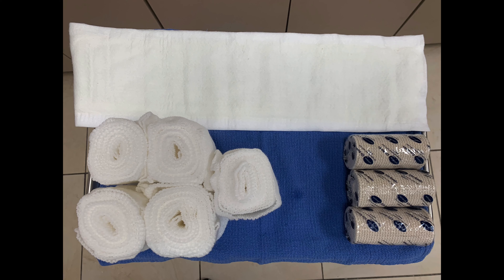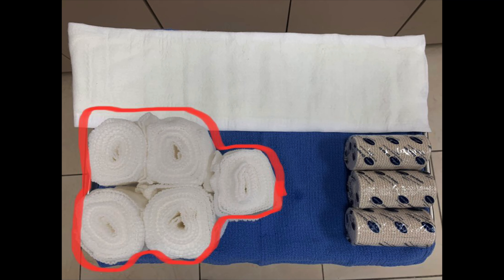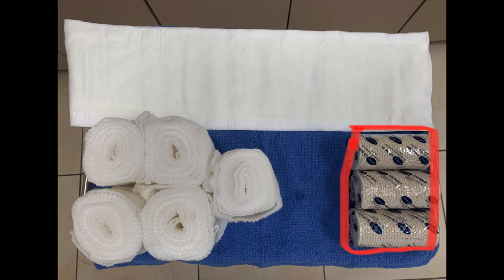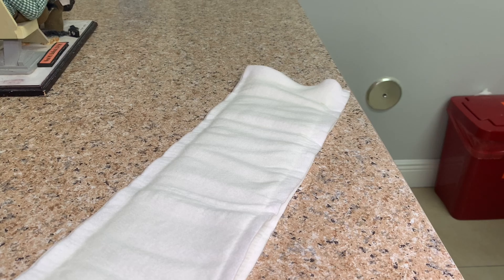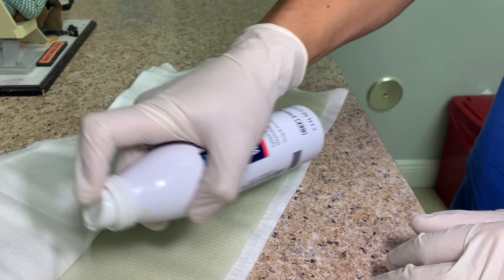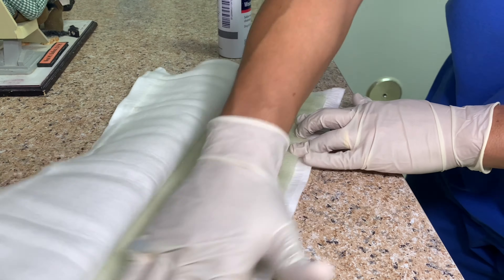The materials needed for the splint are 30-40 inches of 4 inch wide splint material, 5 rolls of 4 inch wide cast padding, and 3 rolls of 4 inch wide ace wrap. I suggest making a heel pad with one of the cast padding rolls and hydrating the splint just prior to starting. Remember, warm water on the splint will cause it to harden faster.